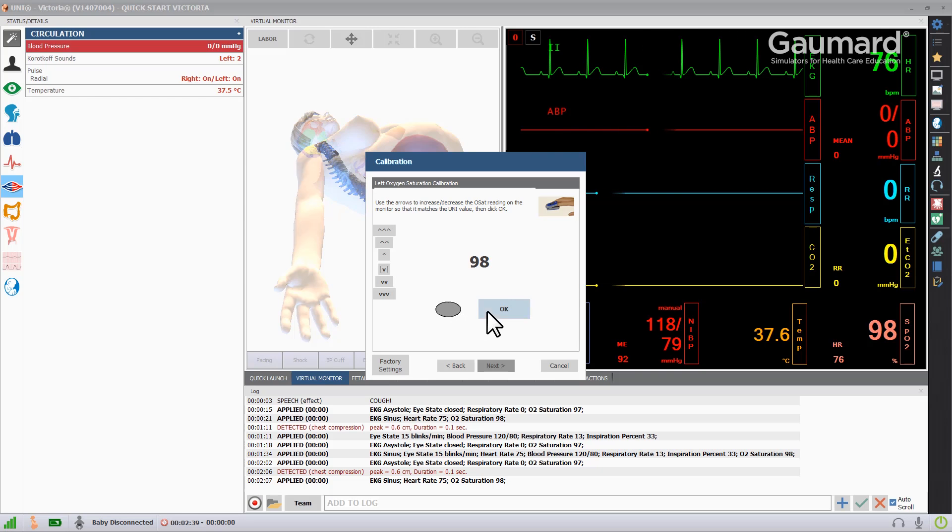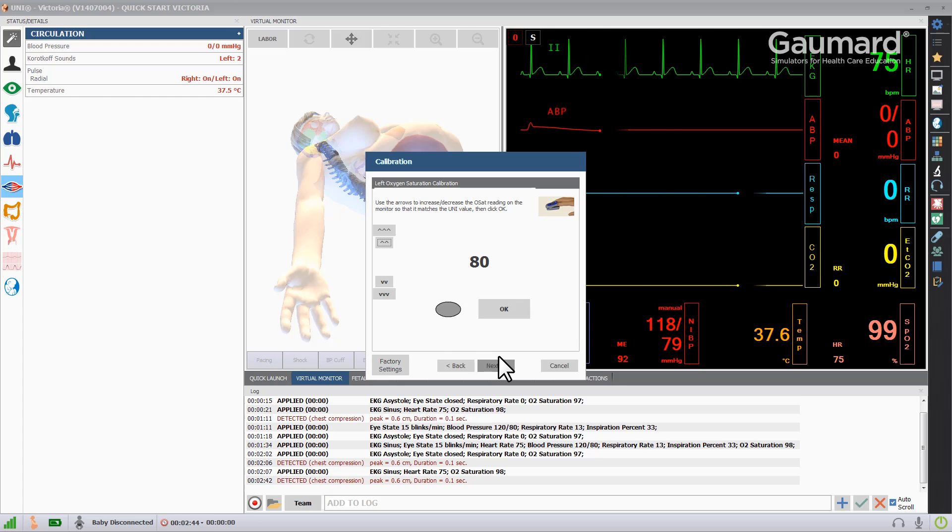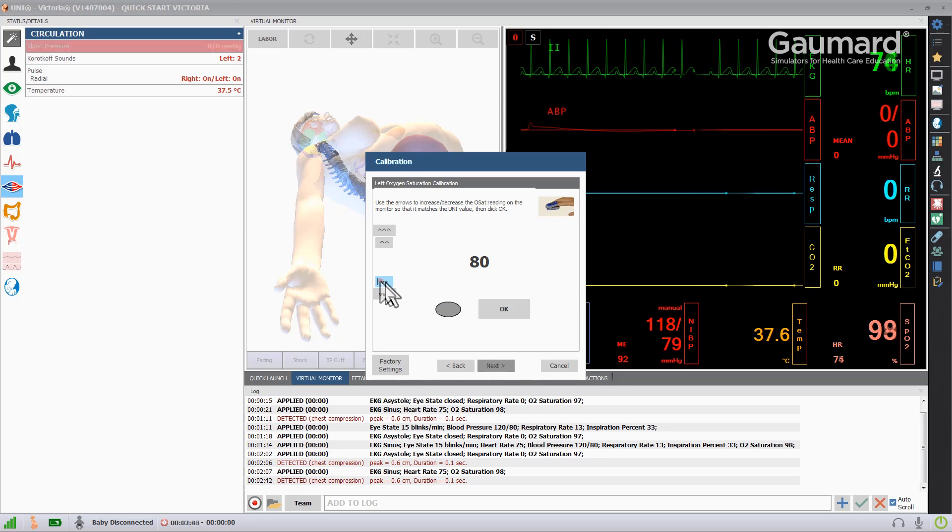Allow the software 20 seconds between clicks so the oximeter can stabilize. When the value on the oximeter matches the value on the screen, click OK.